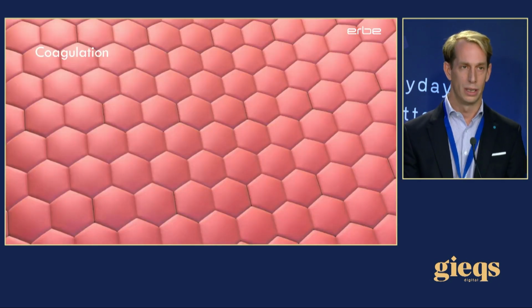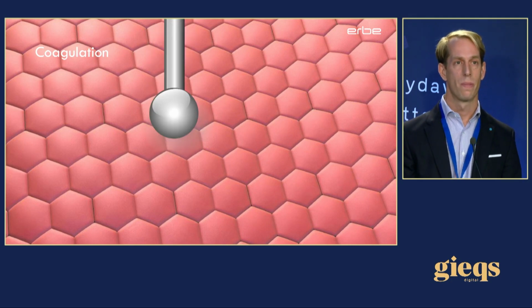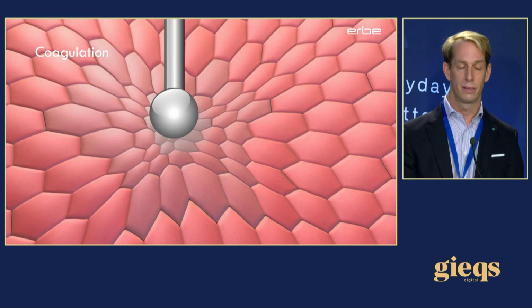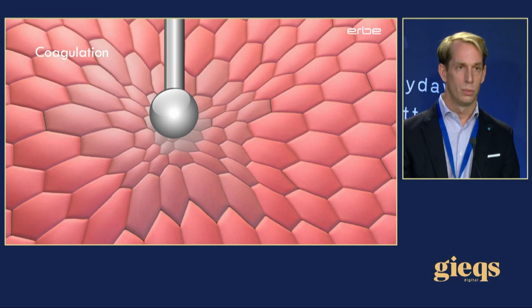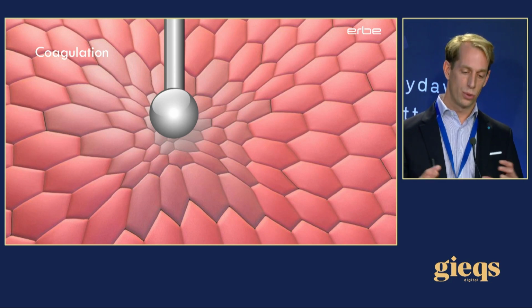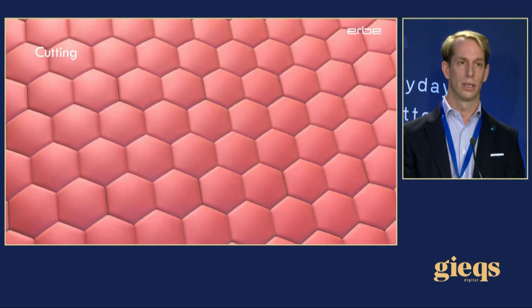We start with coagulation. What is coagulation? Coagulation is shrinking of the tissue caused by desiccation and denaturation of the tissue. So it's the same principle as when you put a piece of meat or an egg in a hot pan. The tissue shrinks together, and this gives coagulation, and coagulation is a sort of hemostasis. Cutting.